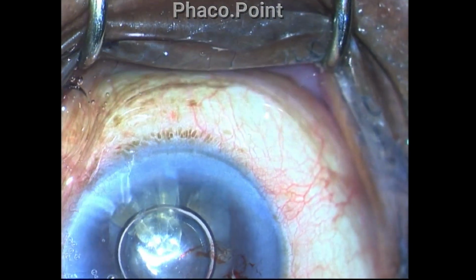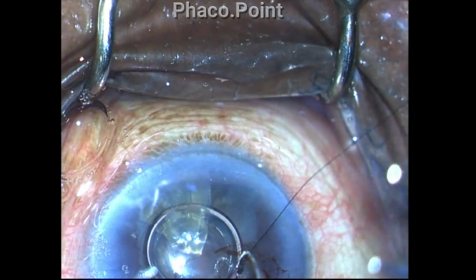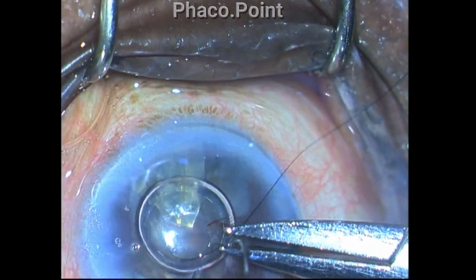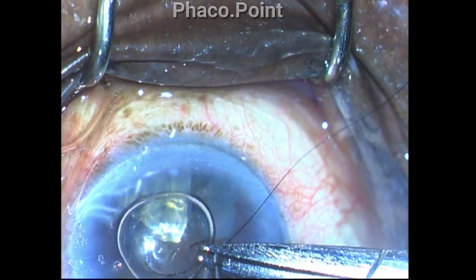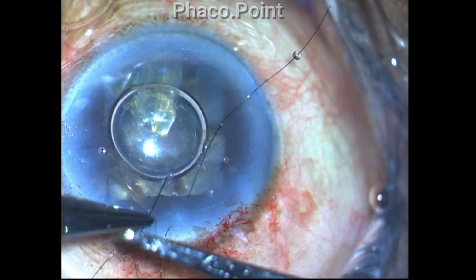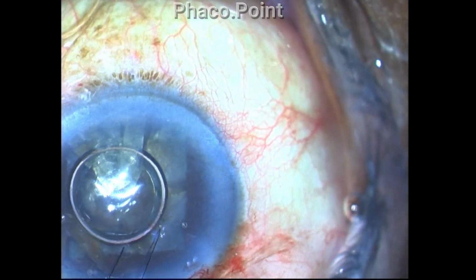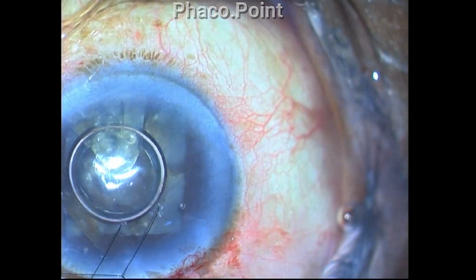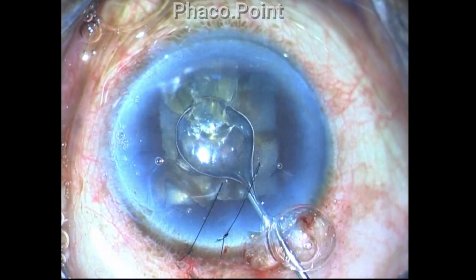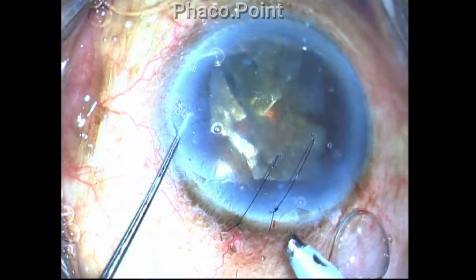2 sutures were taken. Of course, the eye is not properly centered at this point in time, but you will see the 2 sutures soon. So 2 10-0 sutures taken through the cornea to anchor the Descemet membrane in place. And this is taken at an angle away from the clear corneal incision. Well, I am hoping that this would be enough to keep the Descemet membrane in place and make it behave while I perform the rest of the phacoemulsification, and let's see what happens.